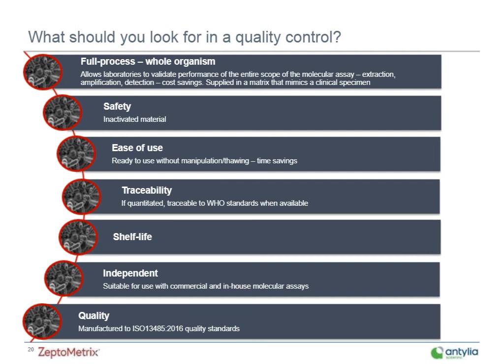Ease of use is also something to consider. You want these controls to be ready to use without much manipulation or thawing. Traceability, if you're looking at a quantitative control. Shelf life, you want something to last as long as your reagents are lasting, or ideally even longer so you can compare across reagent lots. And like we mentioned, you want them independent. And you want to make sure that these controls are manufactured under good quality systems.